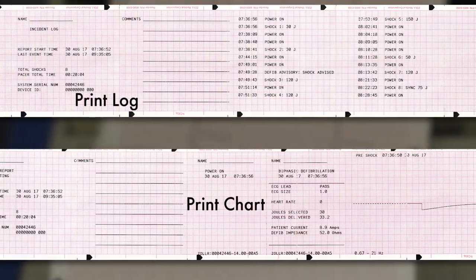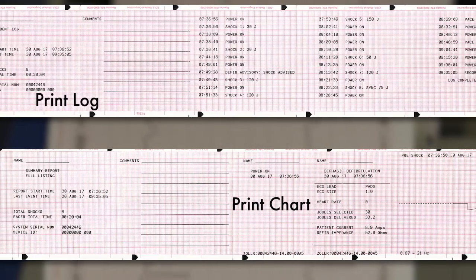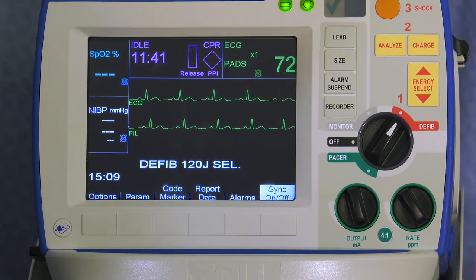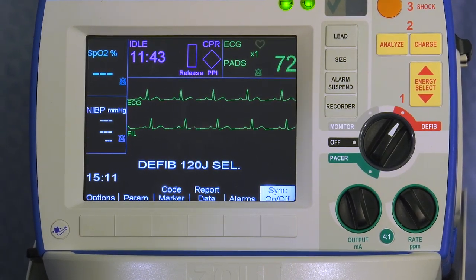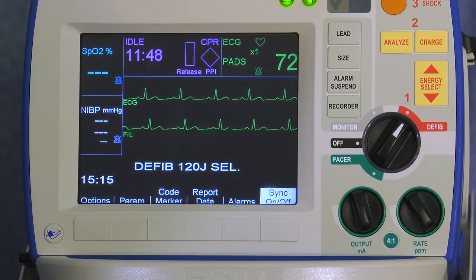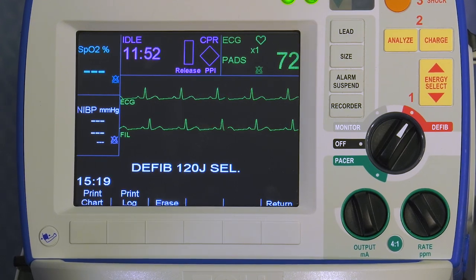You can also access and print two types of summary reports: the print log and print chart. The print log summary report provides a chronological list of all interventions. To generate a print log summary report, press the report data soft key and then the print log soft key.